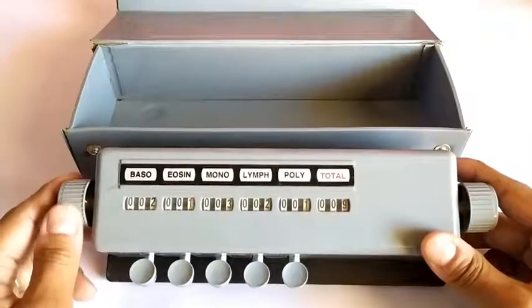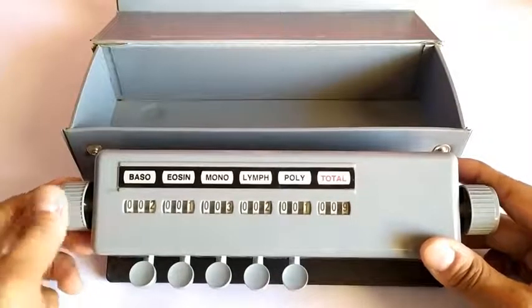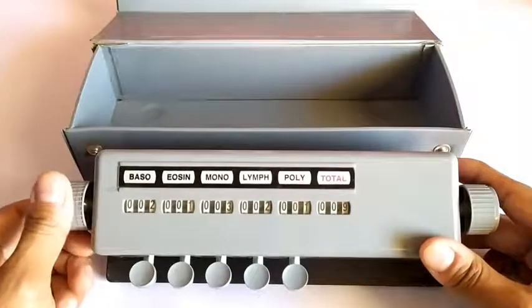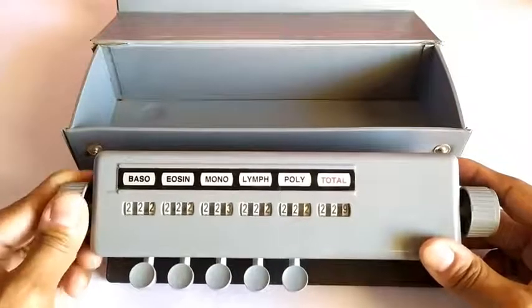You can position the 5 fingers of one hand on the 5 keys while looking through the microscope and proceed smoothly with the counting, although it requires a bit of practice and repetition to familiarize yourself with which finger rests on which cell type key.